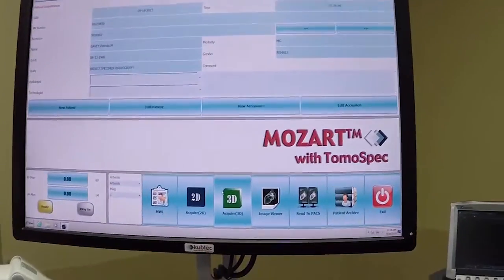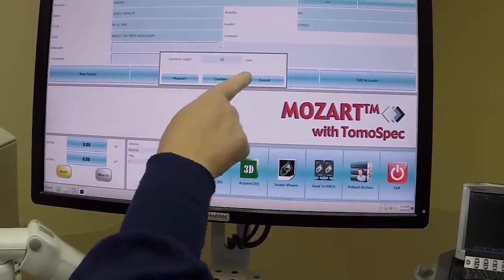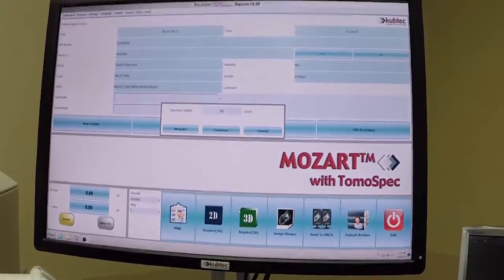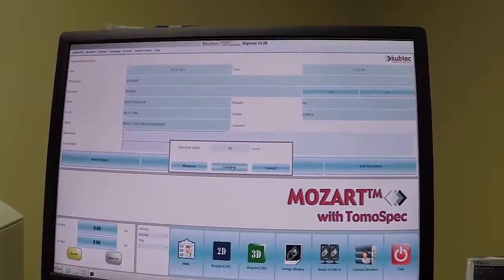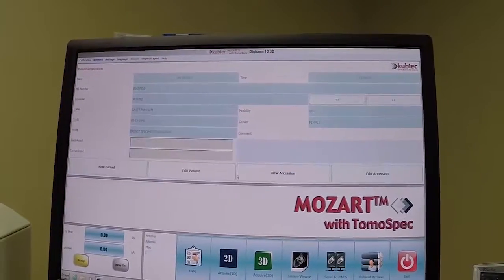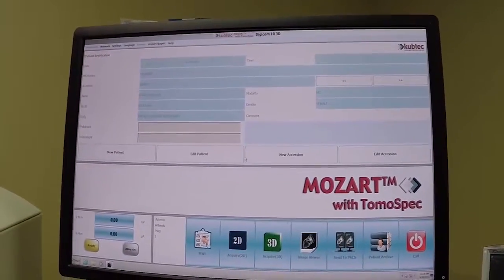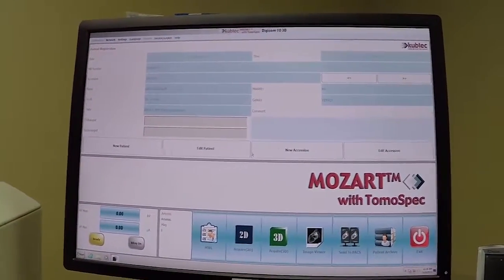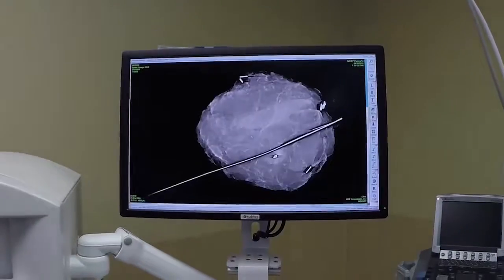So, when you hit the 3D image, it gives you your measurement here. And that's acceptable — in the acceptable range — and then you hit continue to start the x-ray.